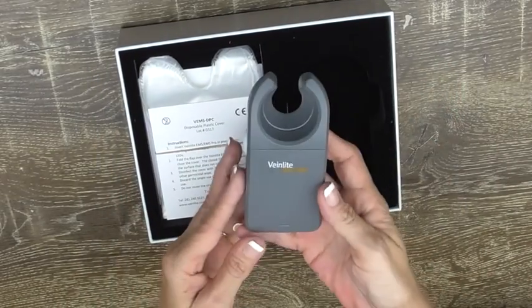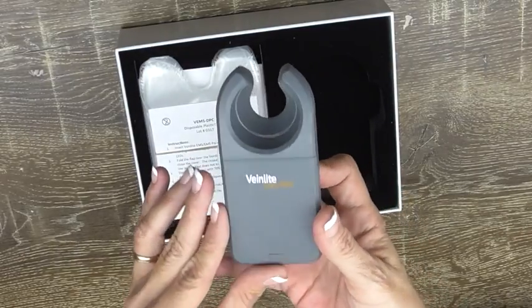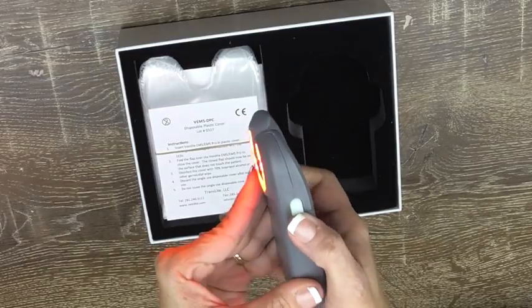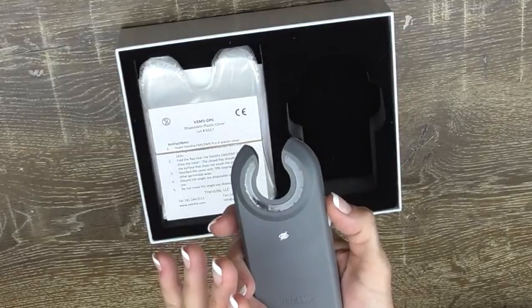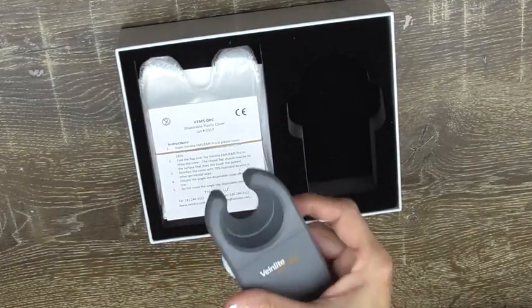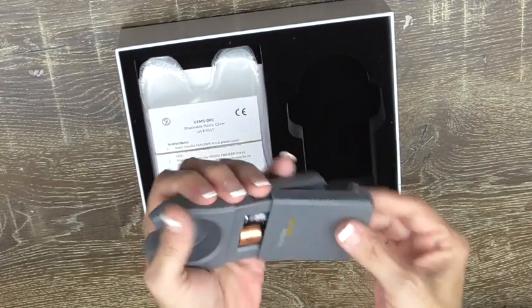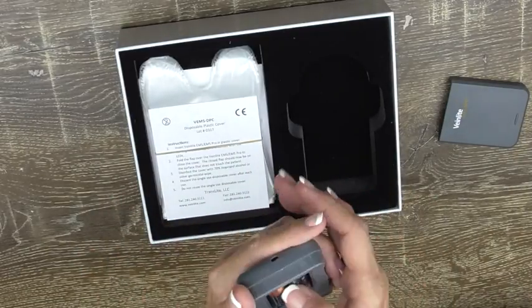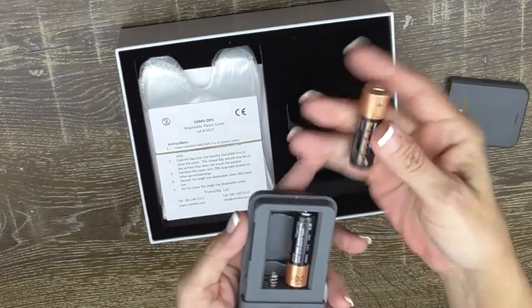So it's a handheld battery device — it's quite portable and easy to hold. It has a side button which you push a few times to change the settings of the lights and to turn it on and off. It's powered by two double-A batteries, and the batteries do come with the package, so that was a bonus.